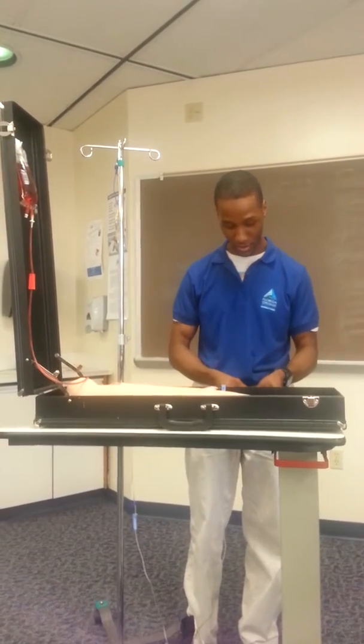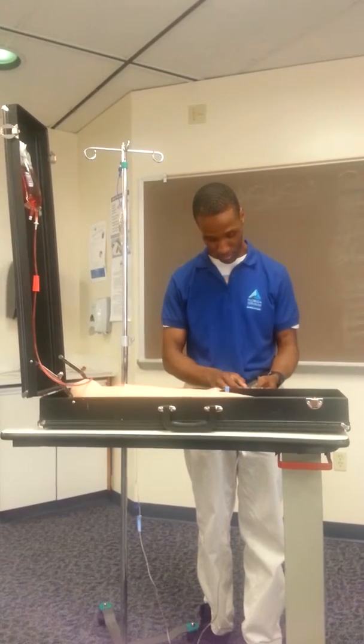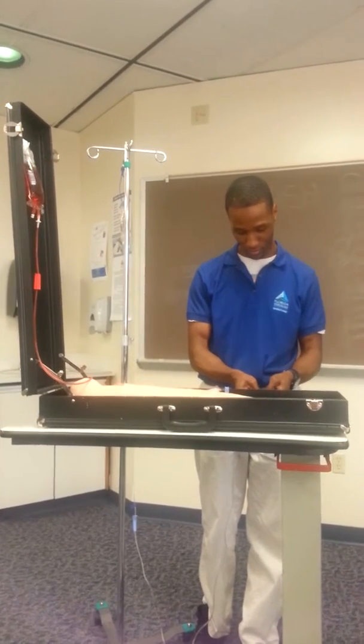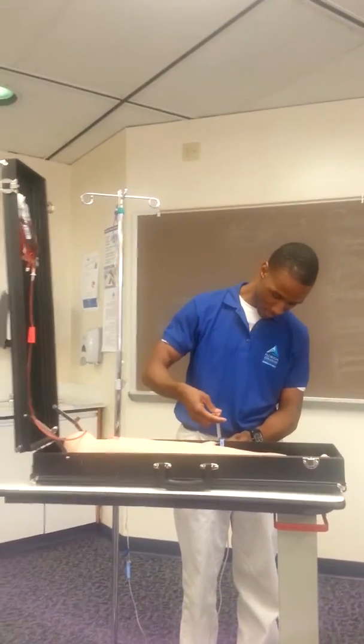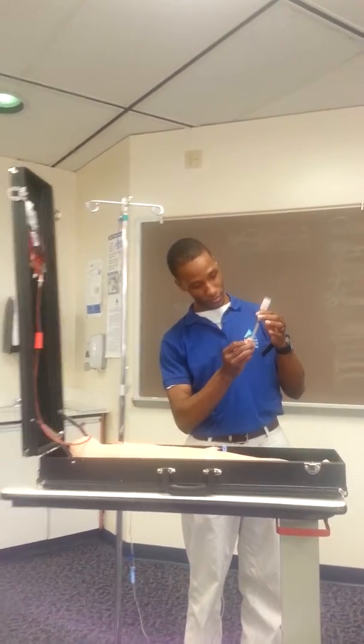I'm going to take my blunt needle and pull back 0.3 mLs of air. Insert. And check 0.3 mLs. Pull back 0.3.